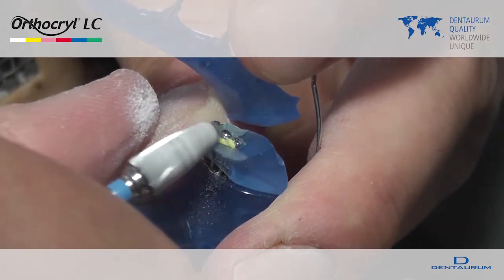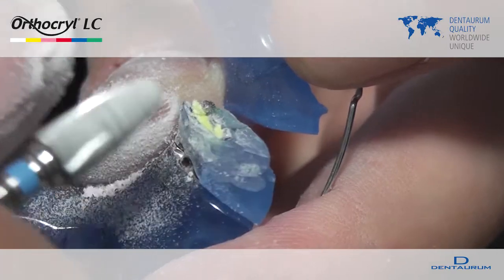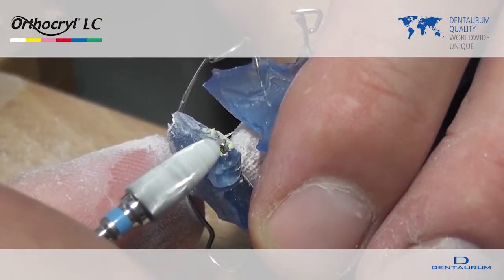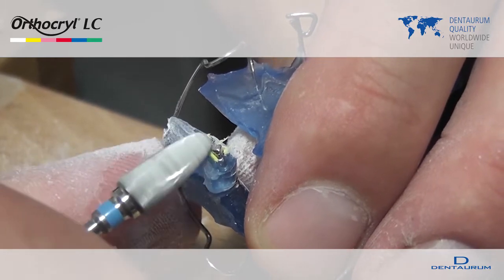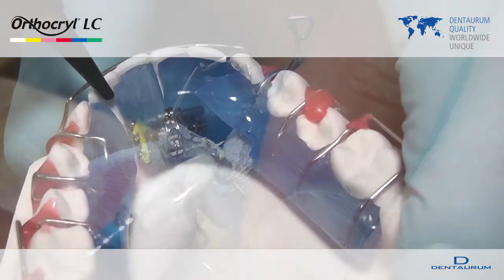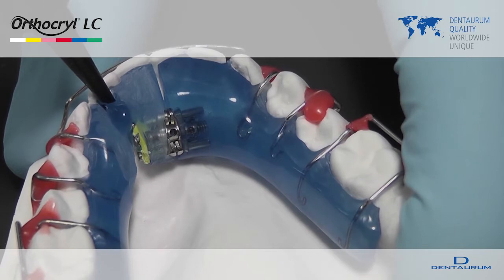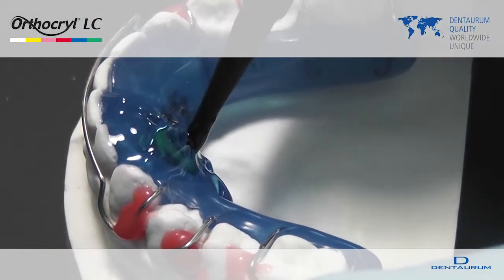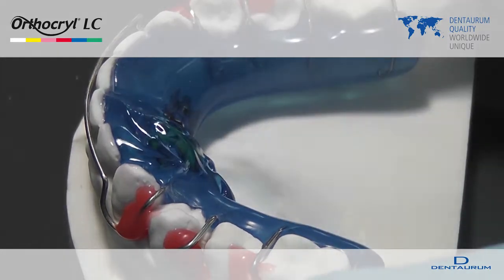Appliances made with OrthoKryl LC can be repaired by using OrthoKryl LC. Roughen the area concerned and remove any grinding dust. The material can then be applied directly. The repaired appliance is then cured in the light curing unit.